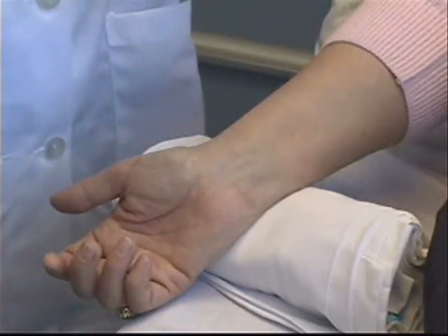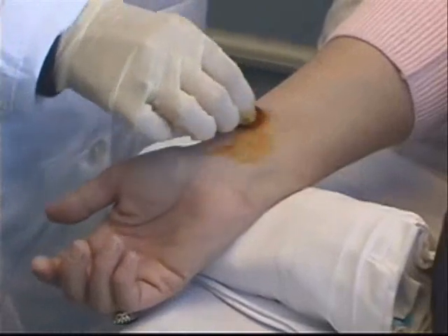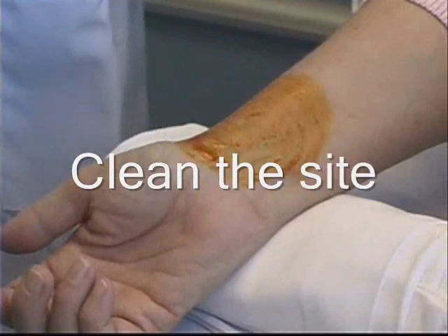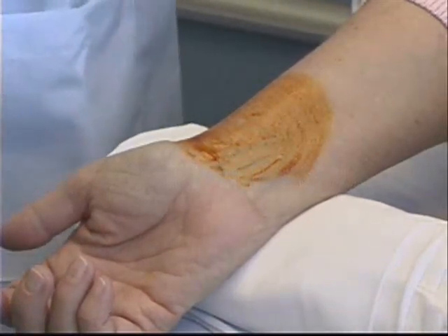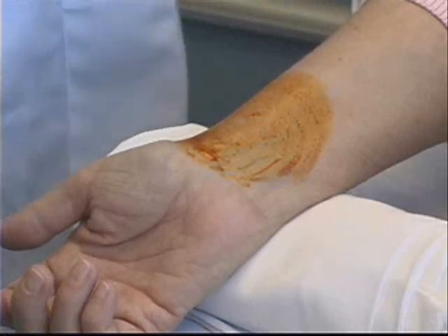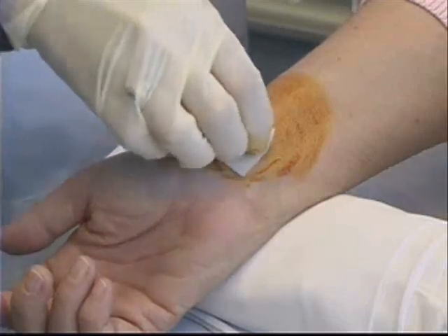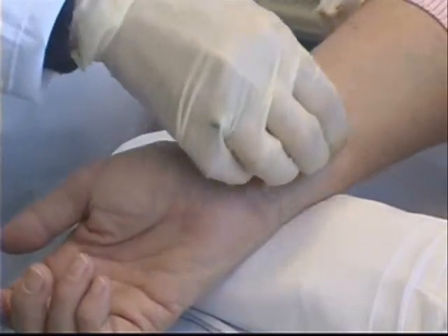The first thing I need to do is clean the area. I'll start with the Povidone-iodine swab, starting in the middle and cleaning in a circular motion. After allowing that time to dry, my next step is to wipe away the Povidone-iodine with an alcohol swab.